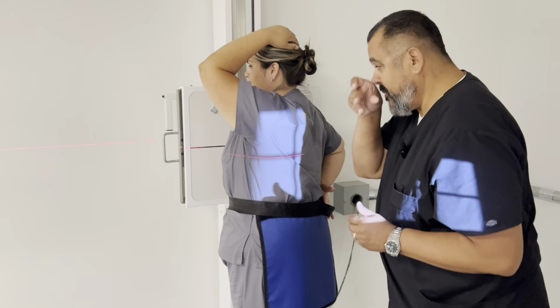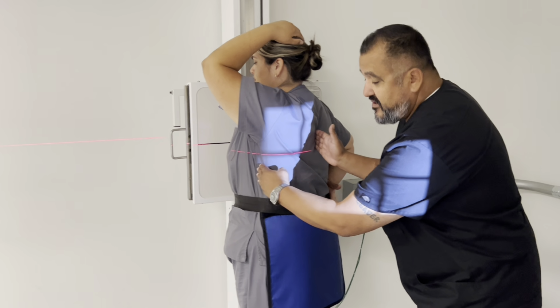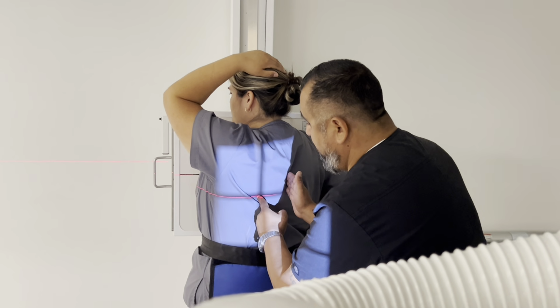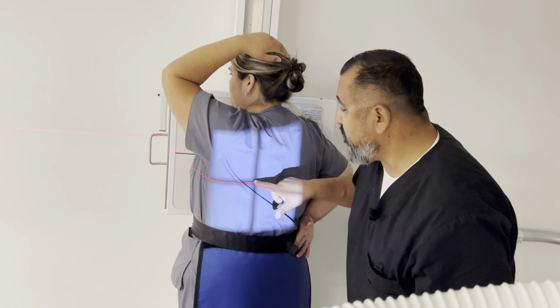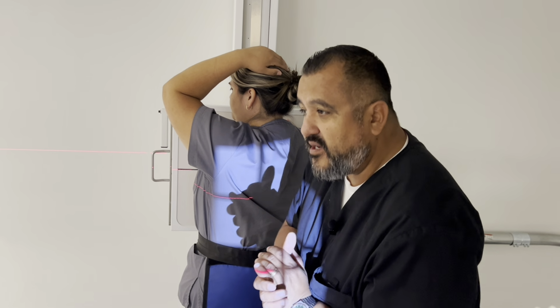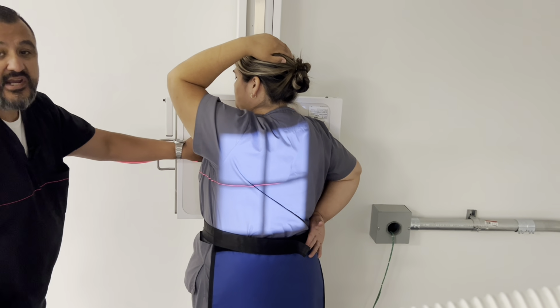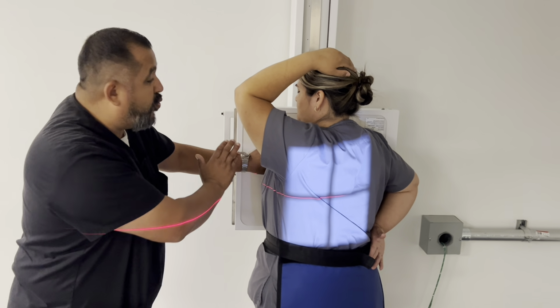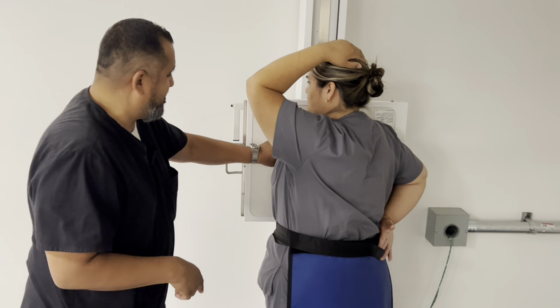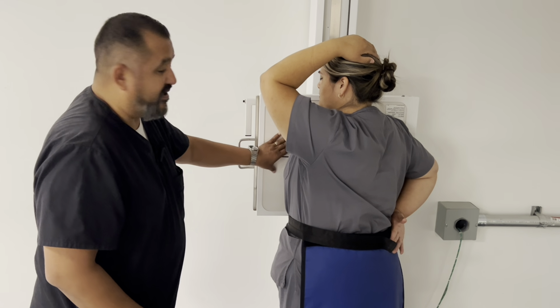I have her turned 45 degrees. I want to show you that the book says that you place the central ray between the spine and the elevated, you guys, side of the ribs here. So you put the central ray right between, and it always ends up, you guys, being right on the inferior angle of the scapula, all right? So if you're using AEC, you would turn on this left upper chamber here. So it'd be the side of interest away from the IR, okay? That tends to confuse some people, but not you guys, because you're going to get it after watching the video and doing your reading. So this is an RAO for the left lung.